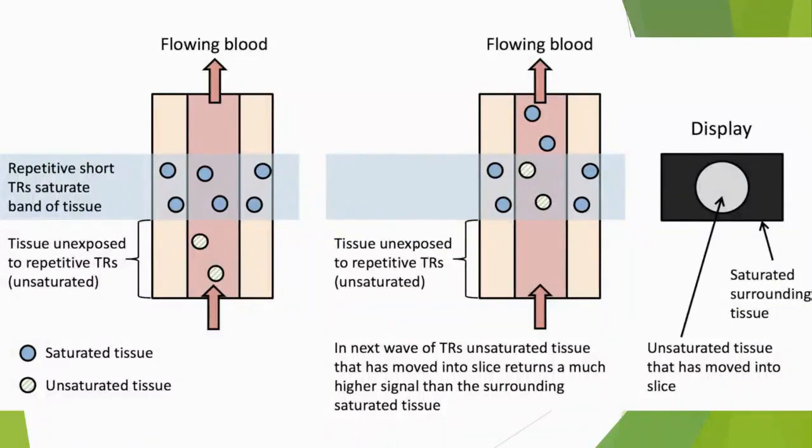Then, after that, the blood flow starts to move and enters this area, and you begin to receive the signal that was present, resulting in higher longitudinal magnetization than the steady state of the existing magnetization. Now the question is, why is this topic somewhat sticky? Is the blood flow correct?